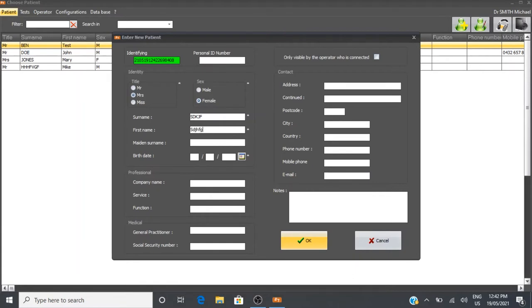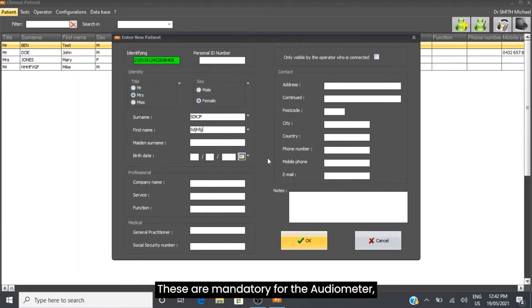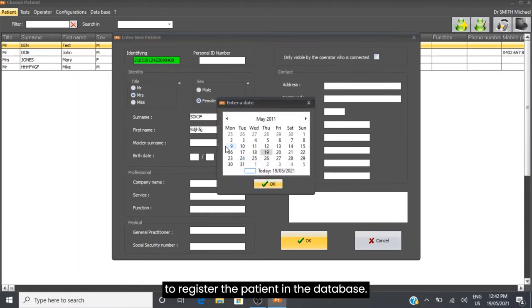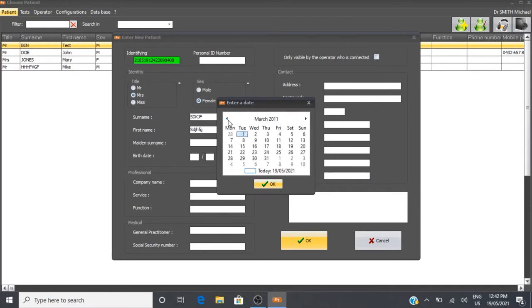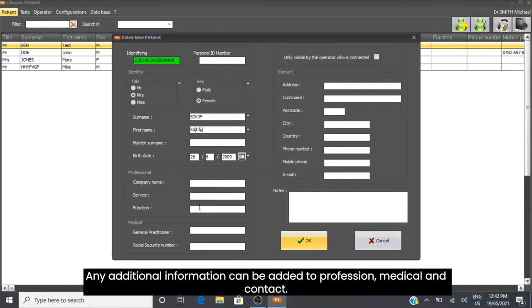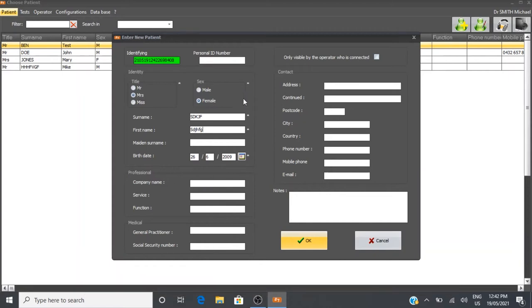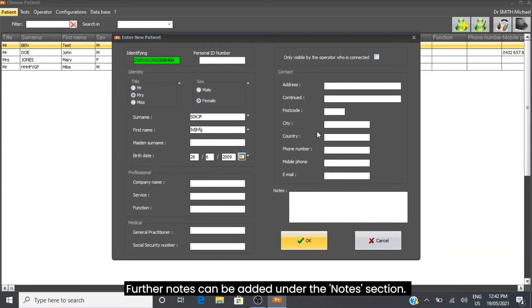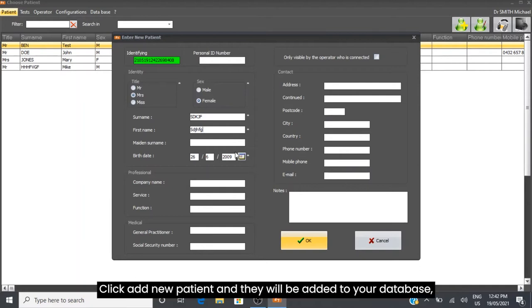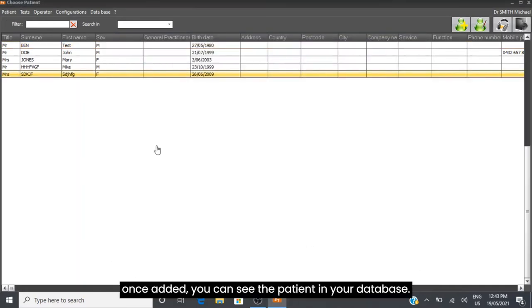Add their date of birth - these fields are mandatory for the audiometer to register the patient in the database. Any additional information can be added to Profession, Medical, and Contact. Further notes can be added under the Notes section. Click Add New Patient and they will be added to your database.